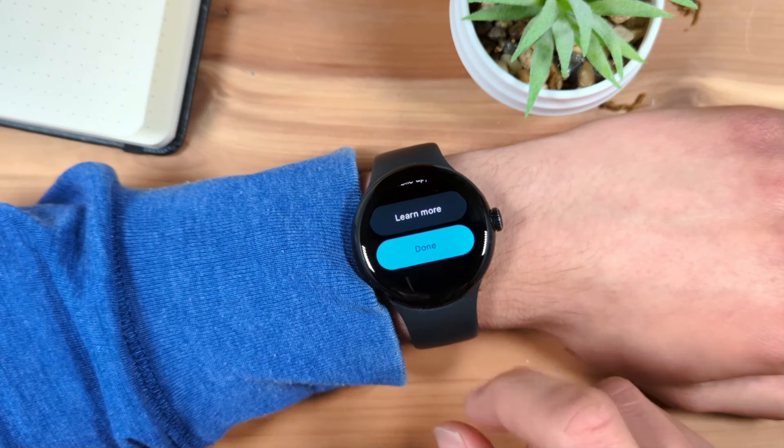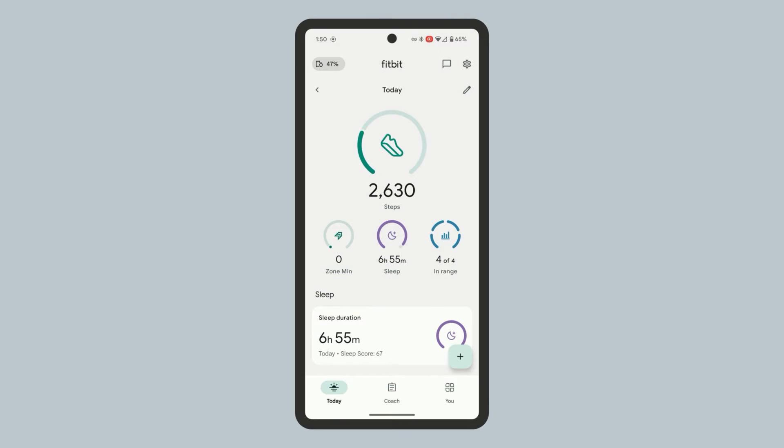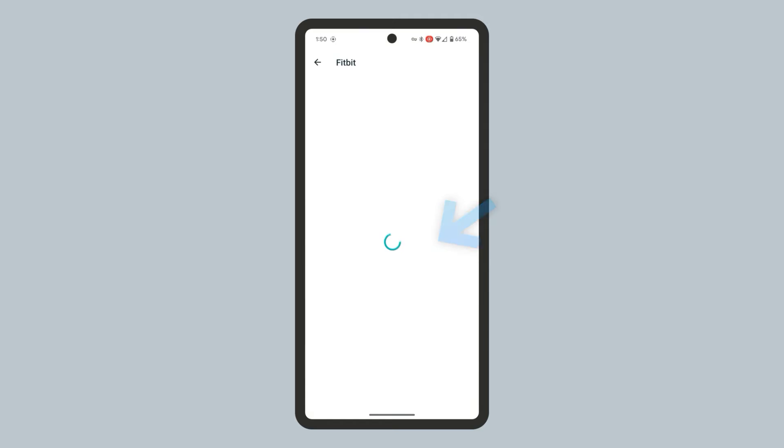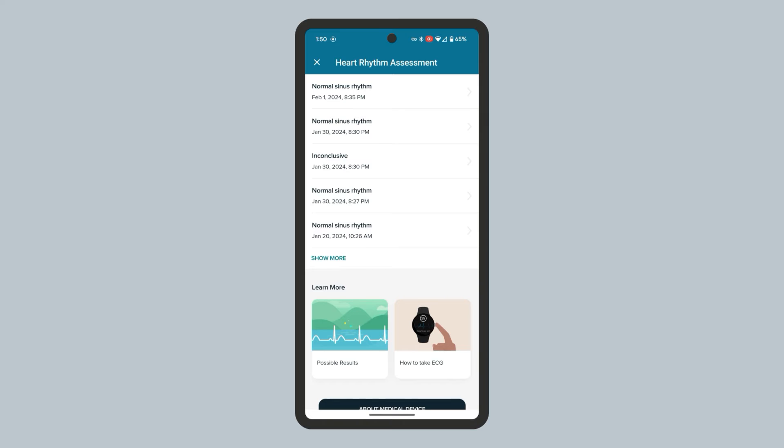You can access a more detailed report of your test from the Fitbit app on your phone. In the Fitbit app, go to the 'You' tab at the bottom right. Under the Health Assessments section, find the ECG tile and tap View History. Here, you can see a history of your ECG tests. Tap one to view it.